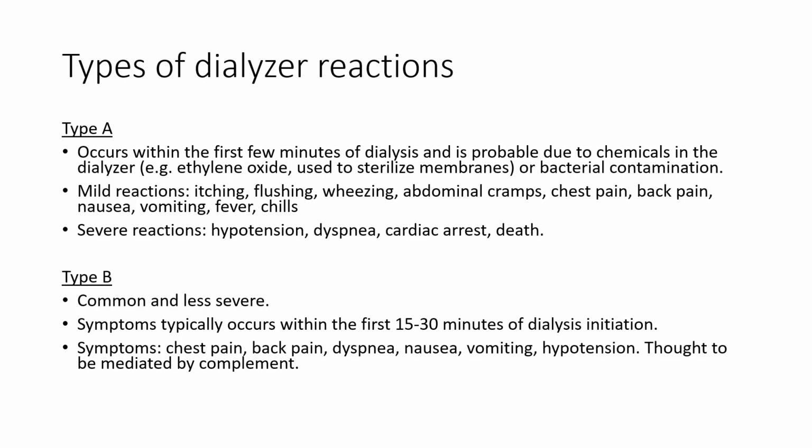So if a patient had a type A or B dialyzer reaction with, say, the standard F160 dialyzer, and then they were switched to a different dialyzer, say a Revaclear dialyzer, but then was dialyzed again with the F160 dialyzer, then the reaction would likely recur with a potentially severe complication. So that's why it's very important to always review the dialysis orders and use the dialyzer that is prescribed.